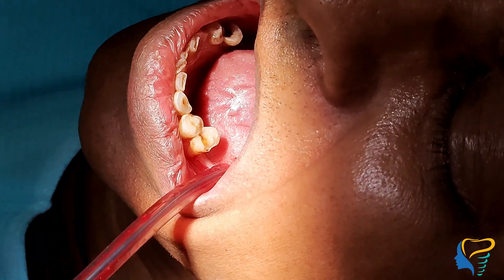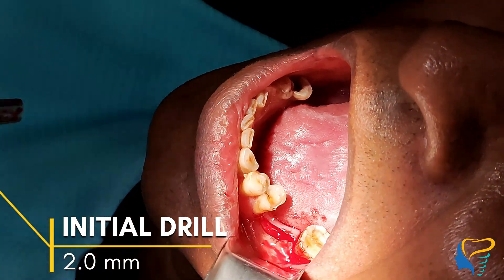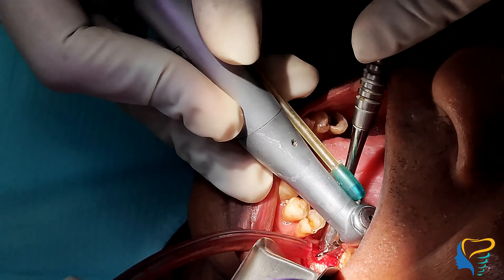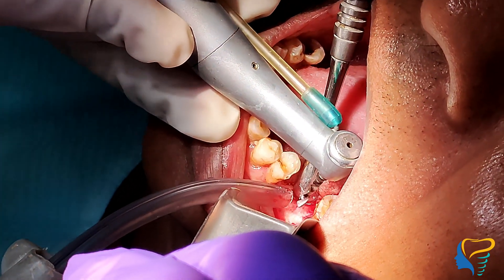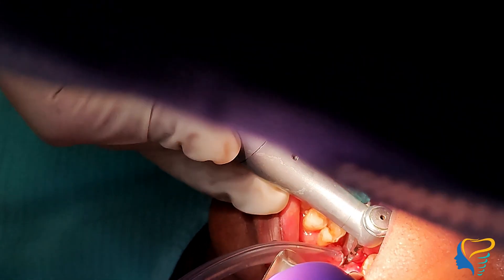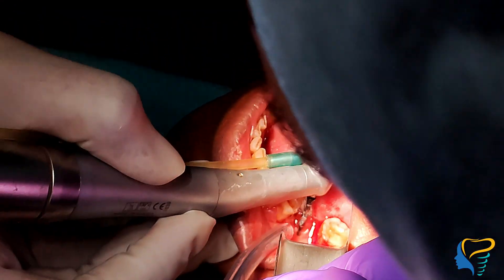Adequate suctioning is important for adequate visualization. Starting with the initial drill of 2.0 mm with a planned depth of 11.5 mm, a speed of 600 rpm and torque of 35 Ncm, entering into the bone to a mild depth.